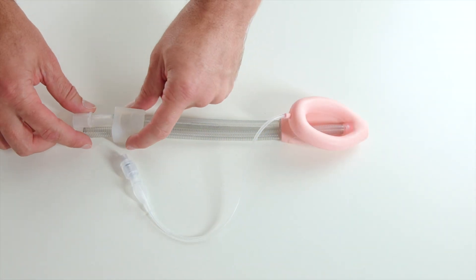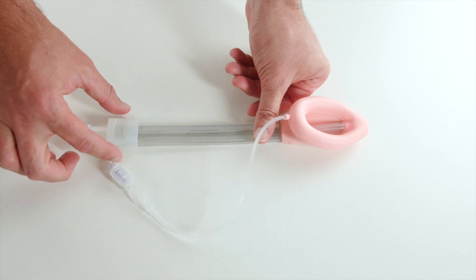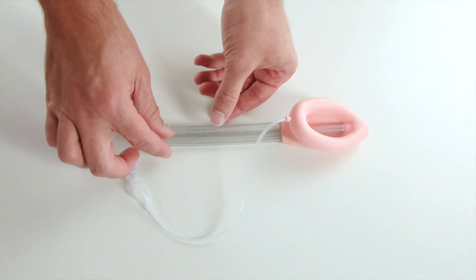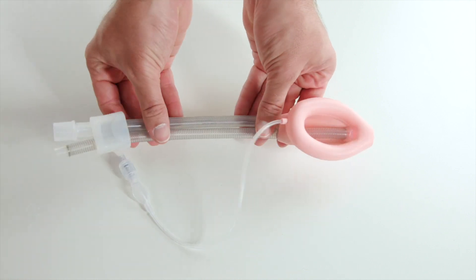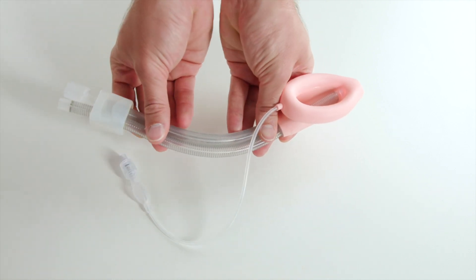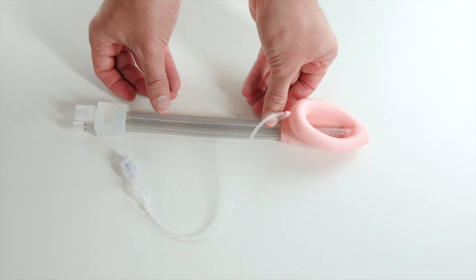The Genesis Flexi 2G SAD with sliding bite block is differentiated from other second-generation SADs by having a flexible wire-reinforced airway tube and separate flexible wire-reinforced drainage tube that bend and rotate independently, allowing the flexibility to be positioned away from the surgical field.